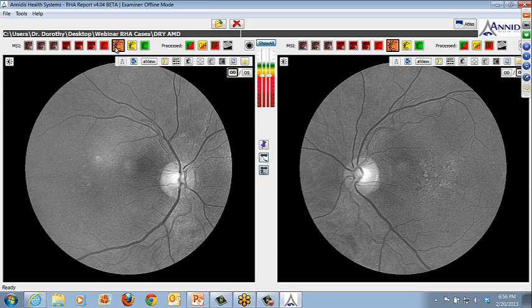So this is something to pay attention to when you have a nicely dilated patient and you're doing a diagnostic screening. And I'll pause there just to remind everyone, remember that the RHA screening is just that. For medical and for legal purposes and for billing and coding purposes, a screening should be distinctly different, and you should expect to pick up pathology on that screening, and this is why you have the infrared, red, and more superficial representations in that screening.